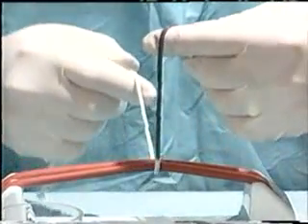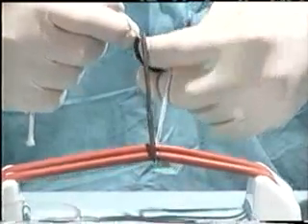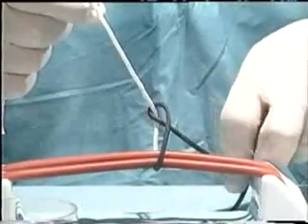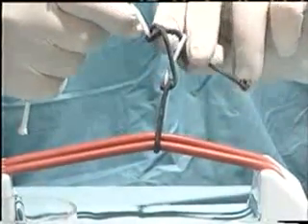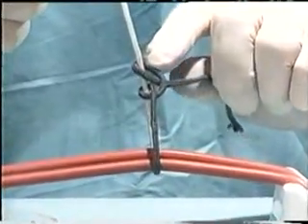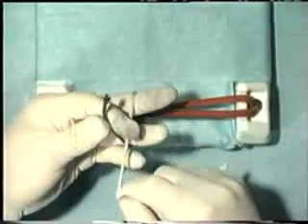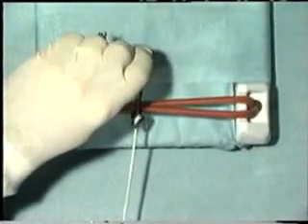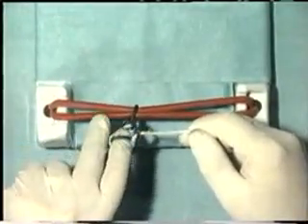Once again, in slow motion, you see 2 of the same throws being cast, using the index finger and snugging that down. And then a similar throw using the index finger again. Once these 2 throws have been cast, push them down into position using the index finger, tightening to the correct tension. A reef knot should be tied afterwards for security. It is absolutely essential that a formal reef knot is tied, otherwise the slip knot will slip and become insecure.